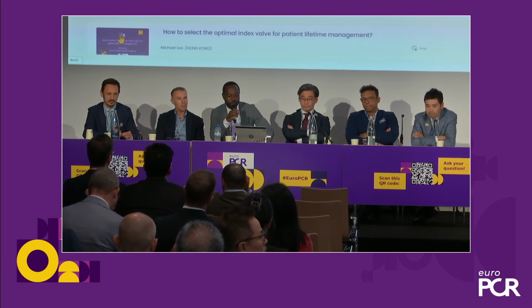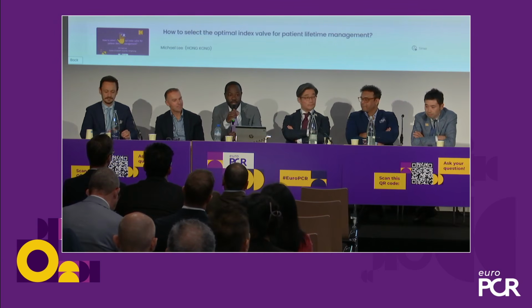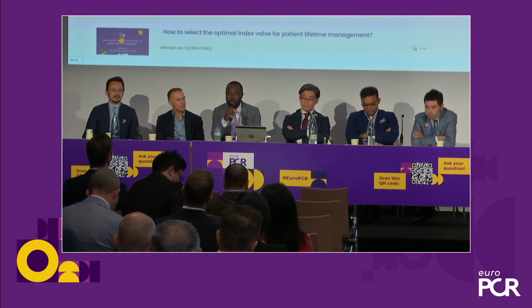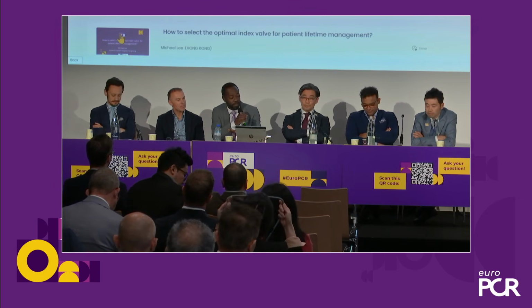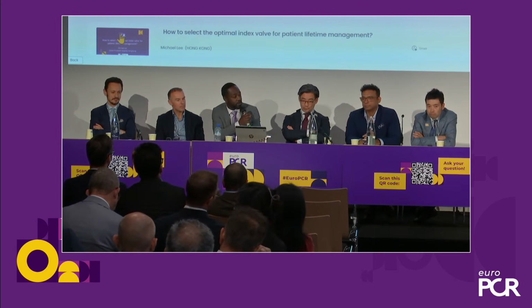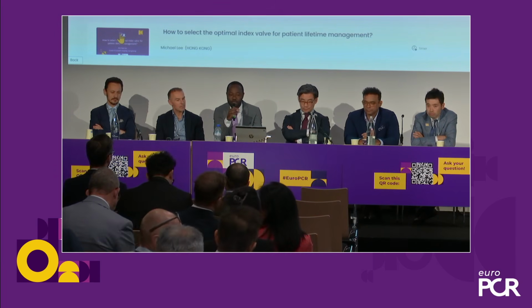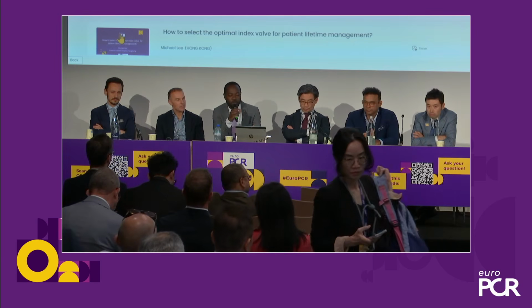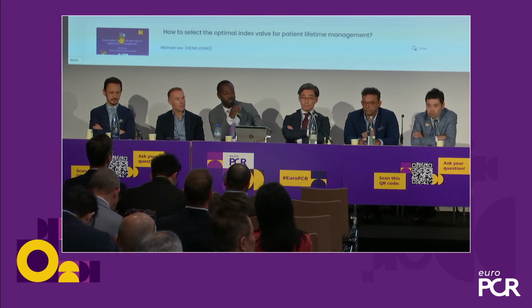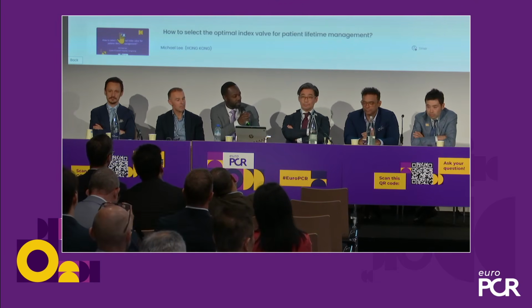So I'd like to conclude by saying that it's very easy to conclude because your talks were fantastic. I learned that with a self-expanding intra-annular platform in a small aortic annulus setup, I can achieve exceptional hemodynamics, large EOA, and very low gradient. And this is extremely reassuring for our patients. I've learned that with a perfect implantation technique, we can keep the door open to the coronary arteries, and most importantly, we can decrease the pacemaker rate to an exceptional level. It's a challenge for myself.